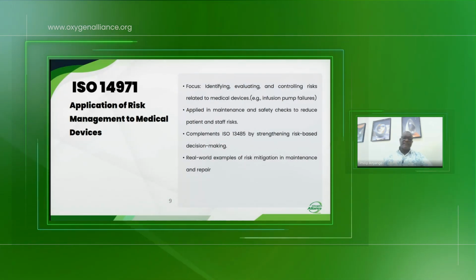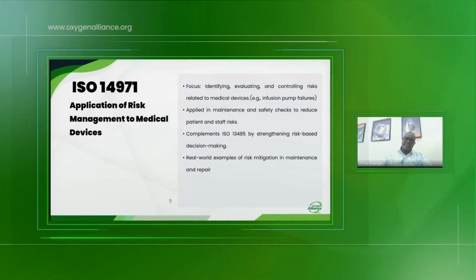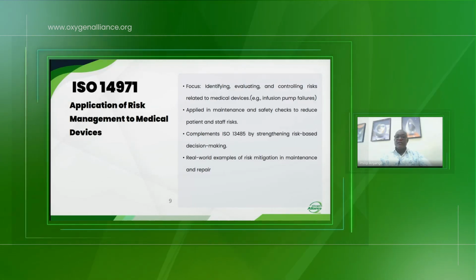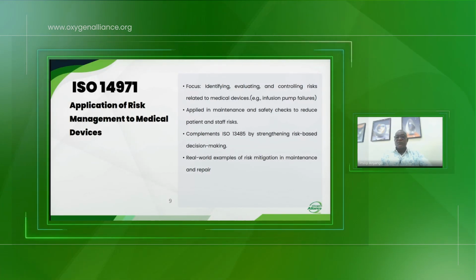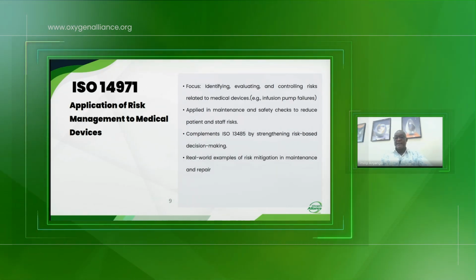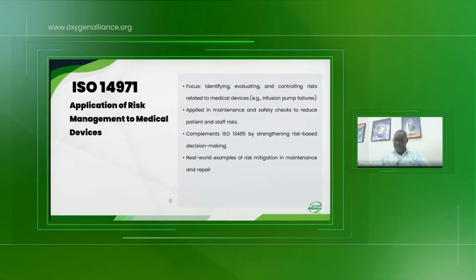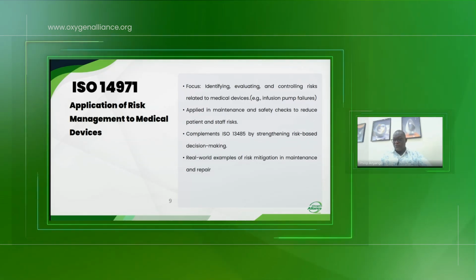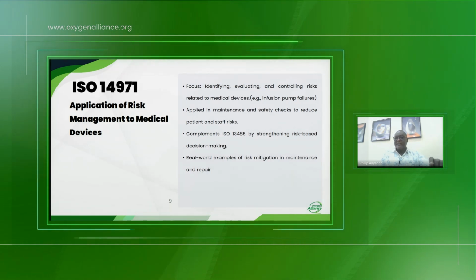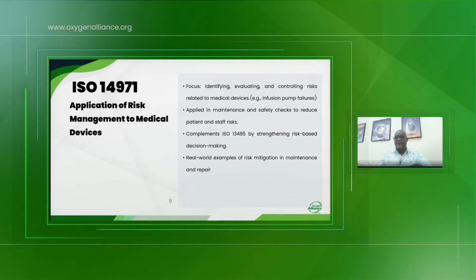ISO 14971, application of risk management to medical devices. This ISO focuses on identifying, evaluating, and controlling risks to medical devices. This could be risk of infusion pump failures, X-ray equipment failure, or electrosurgical unit failure. It evaluates and controls risks that are related to medical devices.